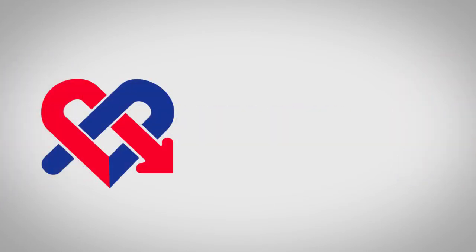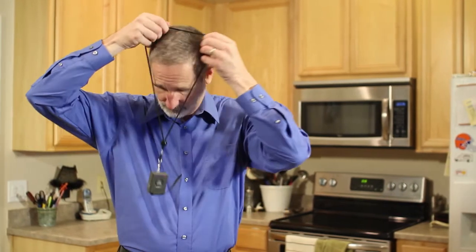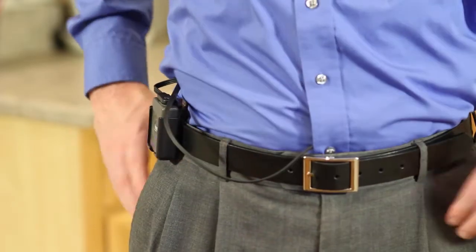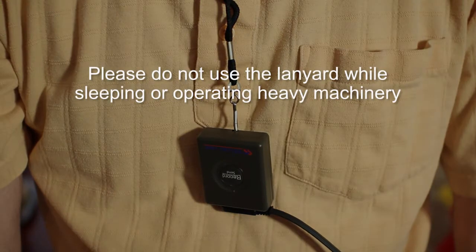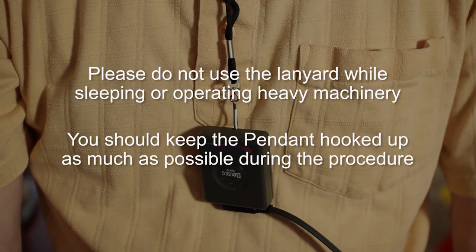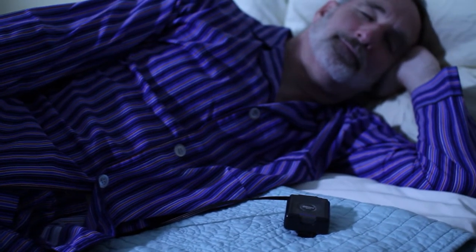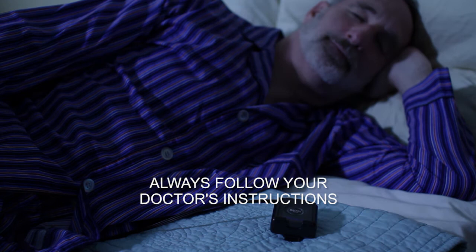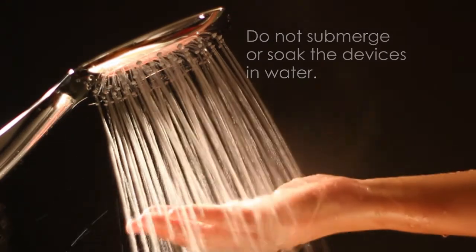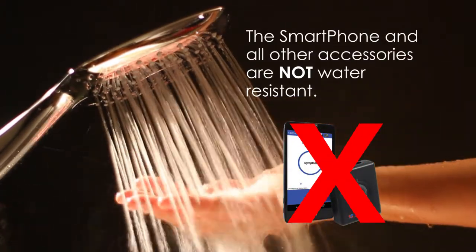Wearing the monitor. You may wear the pendant around your neck using the lanyard or on your belt, or on other clothing using the belt clip. Please do not use the lanyard while sleeping or operating machinery. You should keep the pendant hooked up to you as much as possible during the length of your procedure, including when you sleep and during your regular daily activities — but always follow your doctor's instructions. Do not submerge or soak the devices in water. The handset and other accessories are not water resistant, so please take precautions to prevent the smartphone from any moisture.